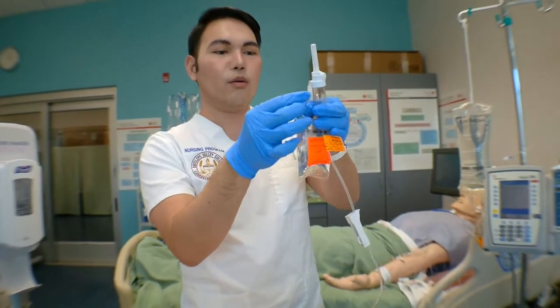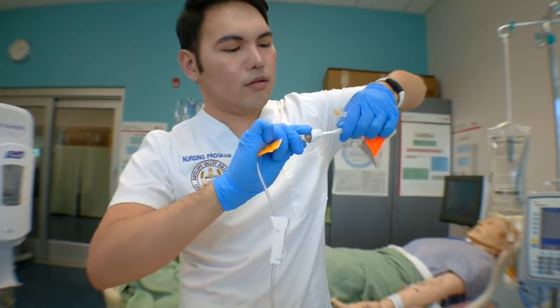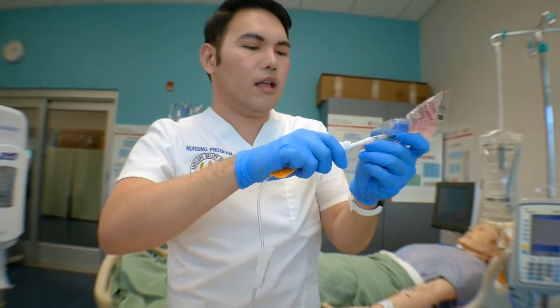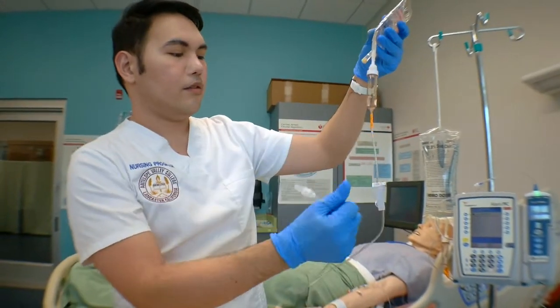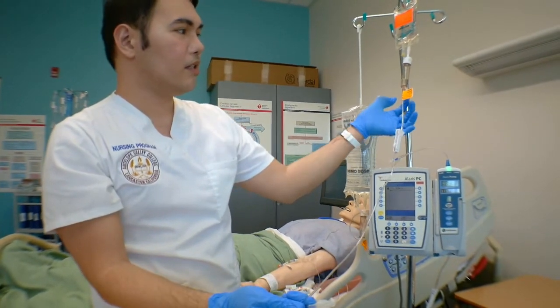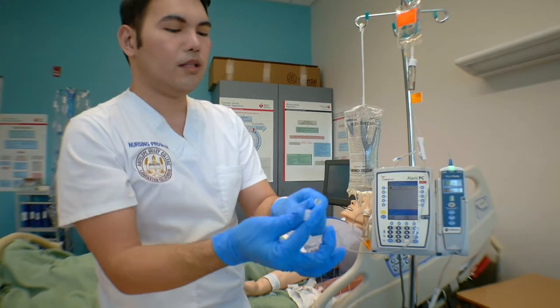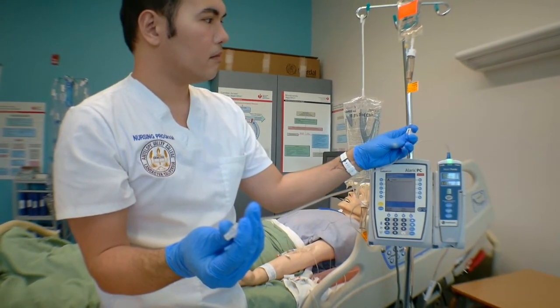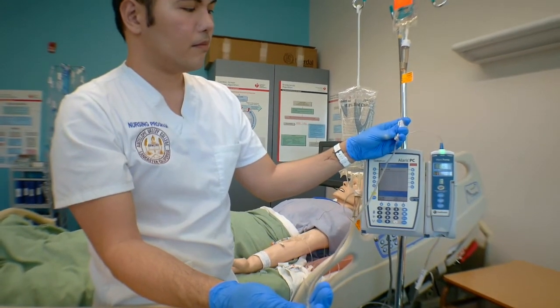Like the primary tubing, you also want this to be sterile, okay? So just gonna roll back and forth until you get half. Okay. So you're gonna squeeze. Alright. So when priming secondary, you want to slowly release it so you could lessen the turbulence on the tubing, so you would have lesser chance of getting bubbles or air in the line. So I'm going to loosen this up. It's infusing slowly.